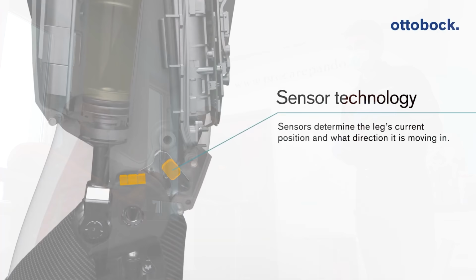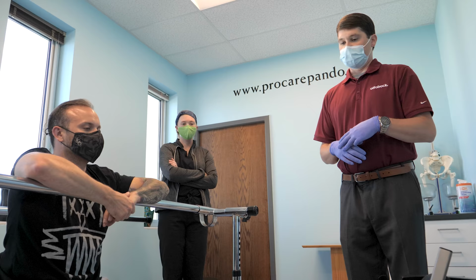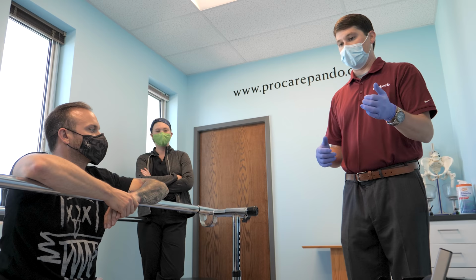There's stumble recovery, so basically that's where the gyroscope and the accelerometer come in. When you're walking in normal gait, if you start to move too fast in one direction or it doesn't feel like it's upright, it's going to ramp up that resistance because it thinks you're stumbling. So it'll allow you to get your sound leg out in front of you, or your hand out if you're bilateral. That's what's really nice. But you can still trip. Just like here I could trip over a branch, you'll still go down. It's not going to stop you from falling, but what it's trying to do is replace those muscles where if I were to stumble, I can seize up and stop myself from going.